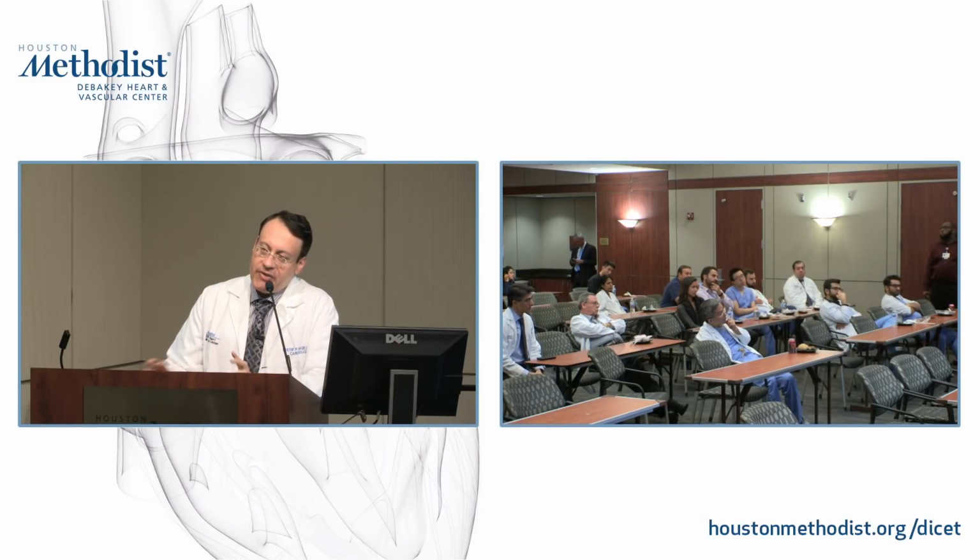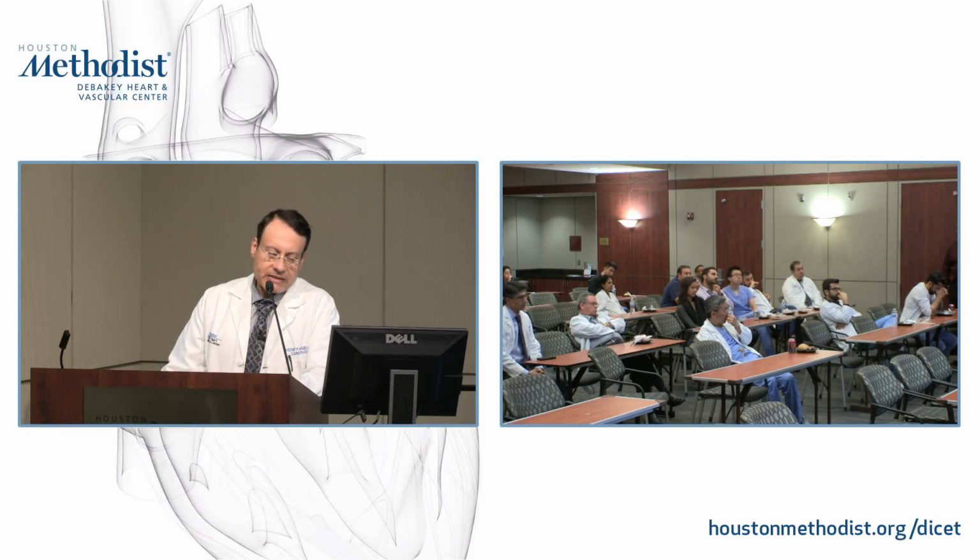But now there is nothing contracting in the pulmonary veins, so it's easier for the LA to send the blood back into the vein. Because this atrium is contracting forcefully, trying to deal with this increased afterload, the a reversal is of a higher amplitude, and the ejection from the atrium into the vein will last longer than the ejection from the atrium into the ventricle.